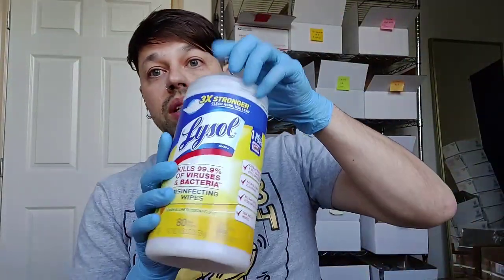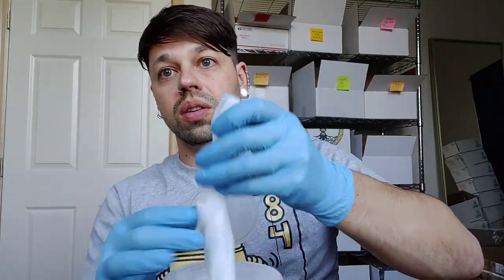Again, always make sure your media is as close to 37°C as possible, at least room temperature. And make sure you sterile filter it, right? The number one problem is contamination, and it's twofold. Clean your environment, right? Get some Lysol wipes. These things are like $5 from Amazon.